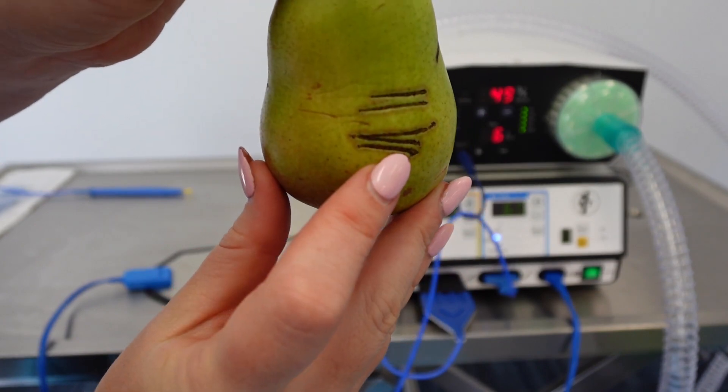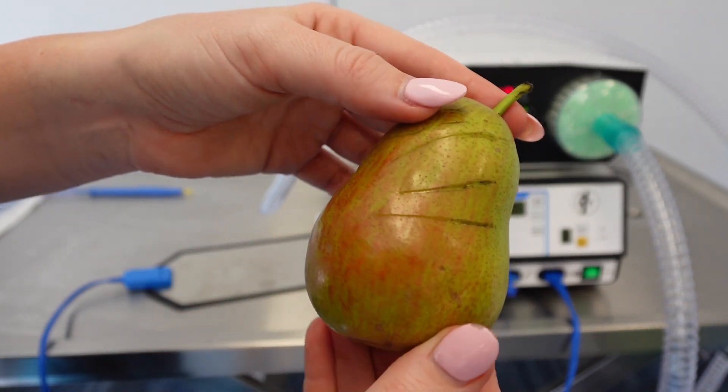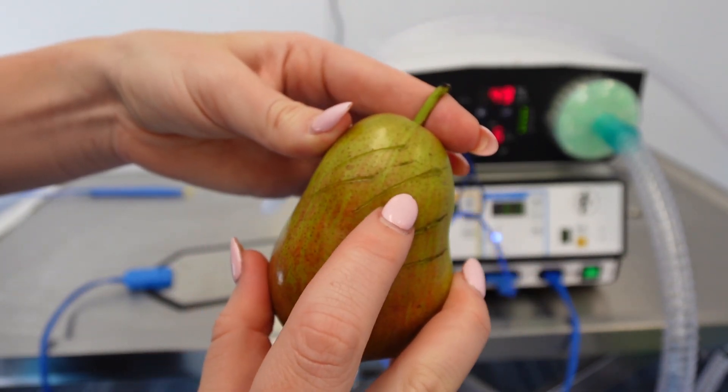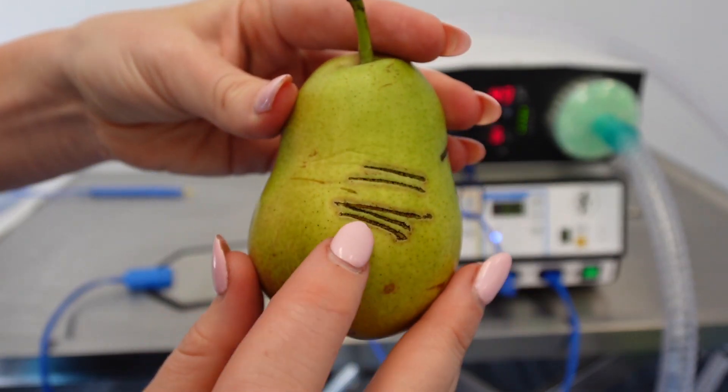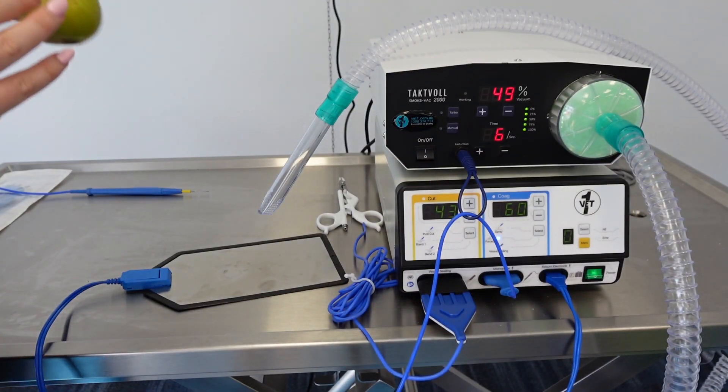Here are a couple of examples showing cutting versus coagulation. The cutting marks are finer with lower settings, while the coagulation marks are thicker with higher settings — you can clearly see the difference. Obviously the results will vary on an actual patient compared to this demonstration material.